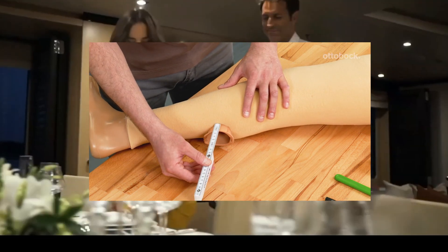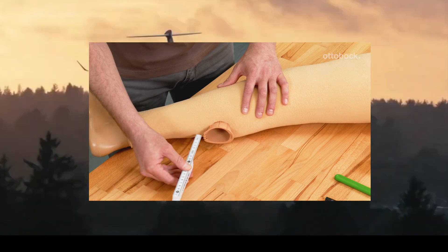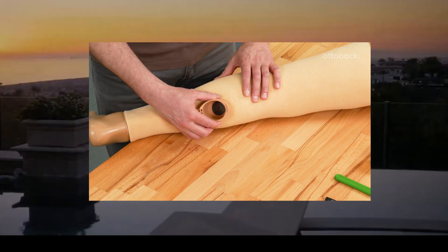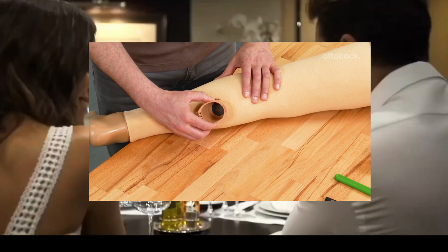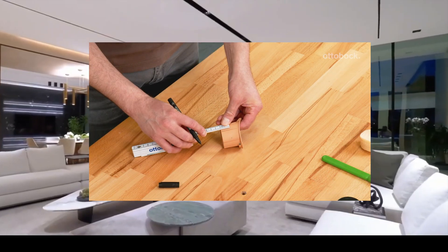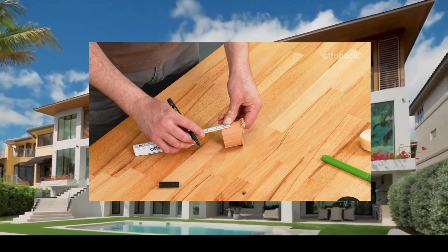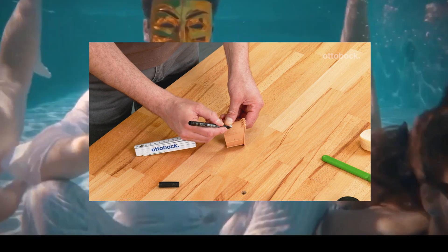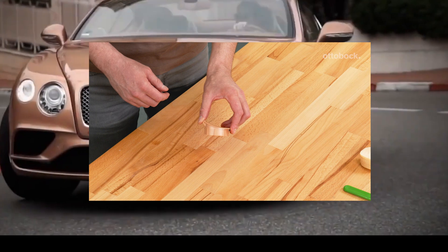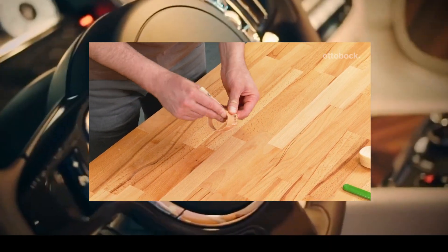Measure the protruding material of the charging shaft. Remove the charging shaft by turning counter-clockwise, then shorten it using a suitable tool according to the measured length. Ensure the cut is perpendicular to the charging shaft, as any deviation may affect the interlocking with the receiver. Deburr and smooth the edges using sandpaper.